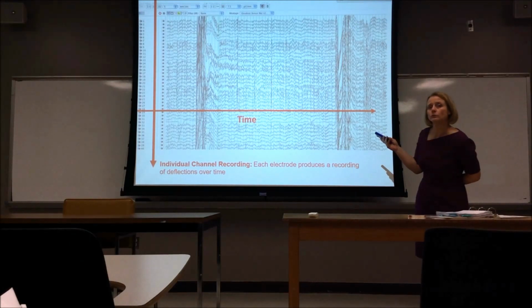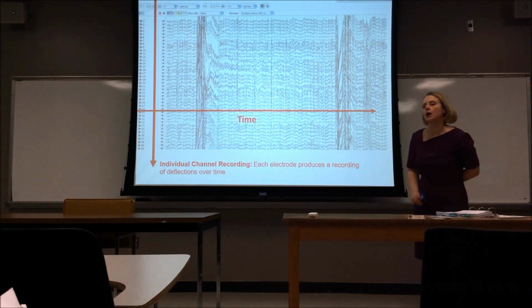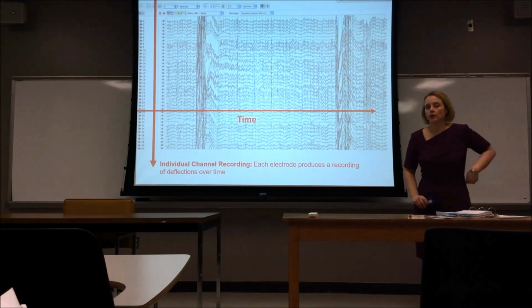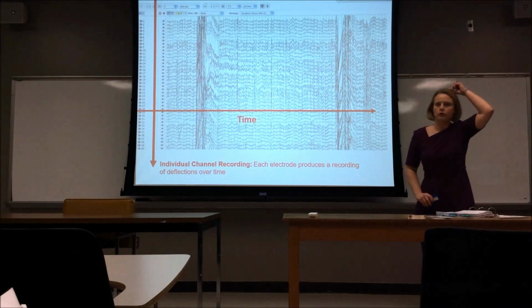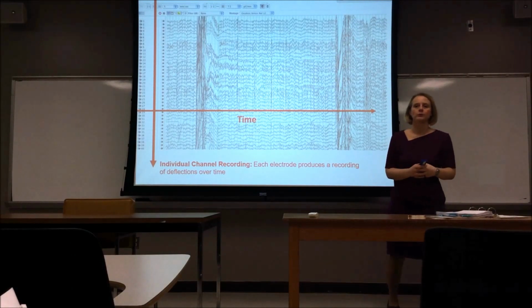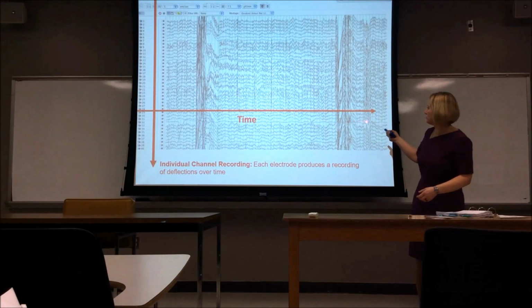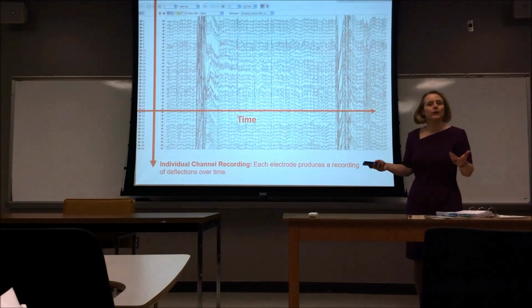Yes. There's one kind of close to the bottom. This guy. What's going on there? So this one does not have good contact with the scalp. And so what Catherine was talking about a second ago about electrodes having a new system, we're always trying to find better ways to have good contact with the scalp. This system uses sponges filled with a salt water-like solution, potassium chloride, and literally what happened here is this one dried out. But I don't care, I've got 128.